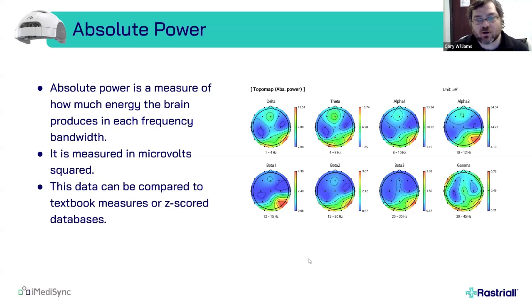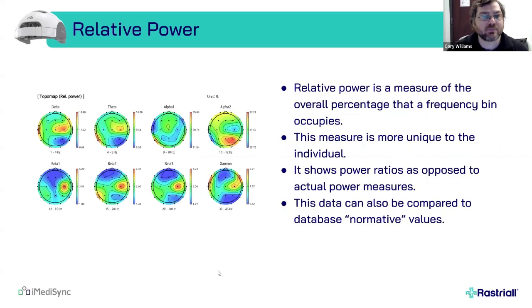So this is the first part of the two-dimensional maps, the absolute power maps. We also get to look at what are called relative power maps. And these show us a percentage of the whole. What percent of all of the activity is in a given frequency bandwidth at a sensor location? So instead of comparing to a database, although we can compare this to databases, this is a little bit more individual specific. It tells us within an individual brain what the power ratios look like. Is there activity that's more prevalent than others?